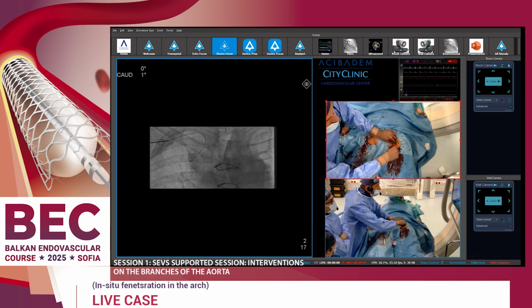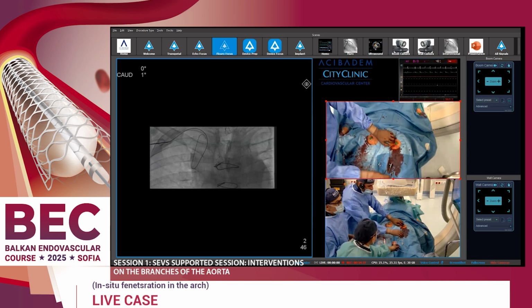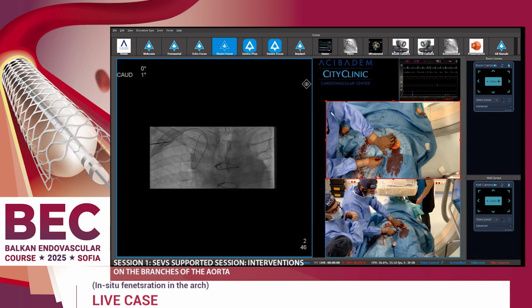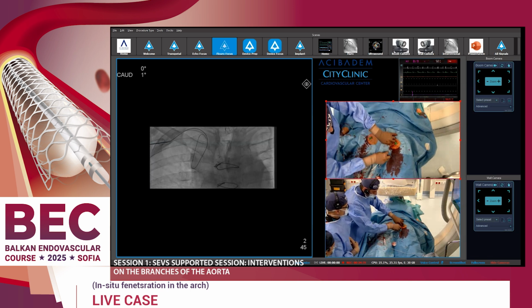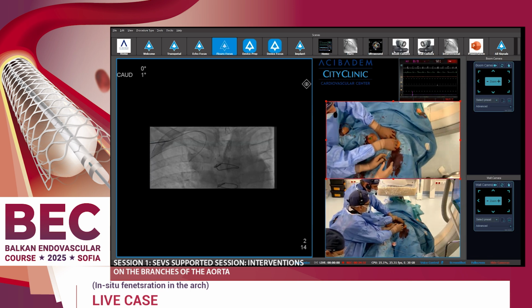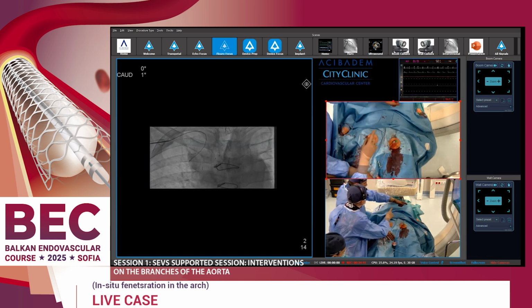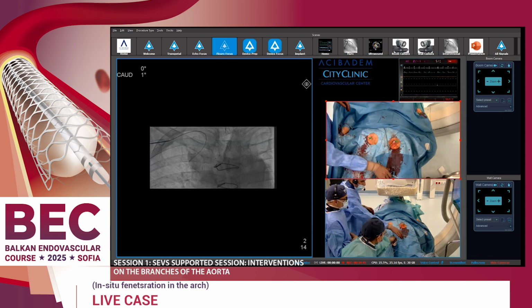So we are going to have six vascular accesses: both radial arteries, both axillar arteries, and a retrograde left carotid puncture. In fact, the retrograde left carotid puncture is already done, and of the axillary arteries, only the left. Left brachial, okay, excellent.